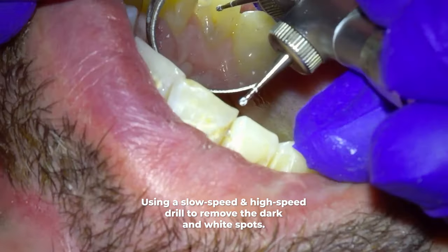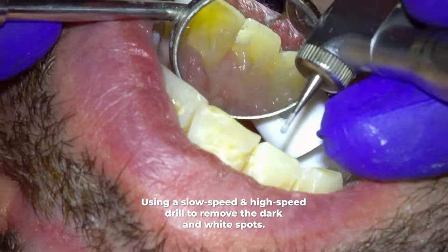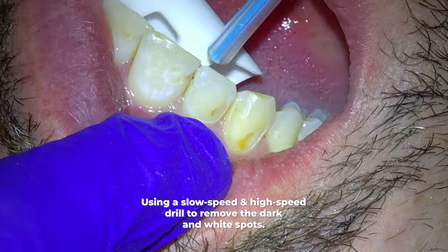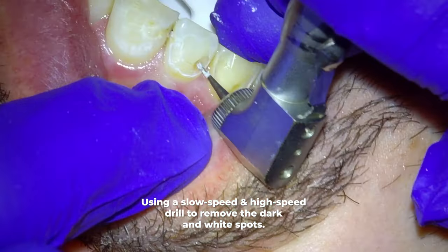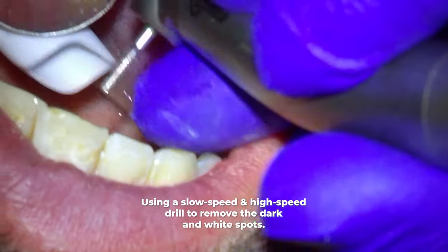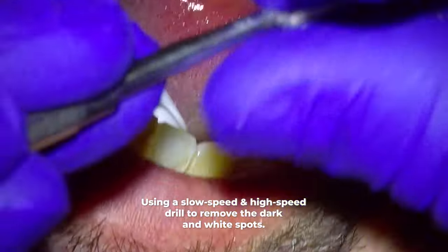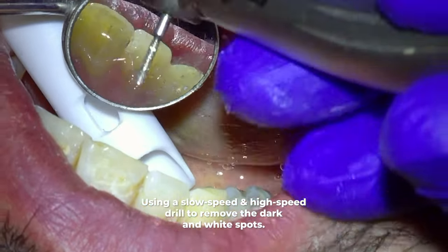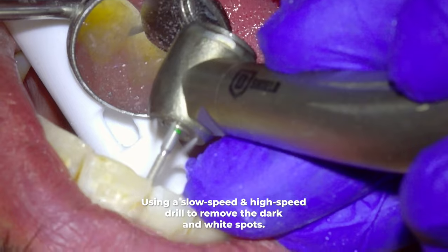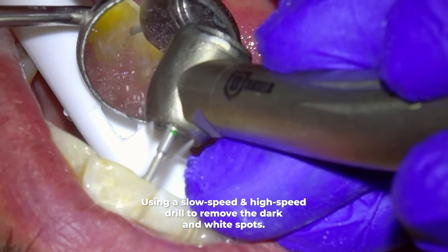Besides getting to the more dusty tooth debris, you can tell decay is gone by a more yellow appearance of the dentin, instead of the orangey or brown appearance as we saw before. Going back to the between-the-teeth area, I'm going to remove the remaining decay with the high speed drill until the dark is all gone, then get any remaining decay with the slow speed drill again. You don't have to remove all the decay with the slow speed drill — I just did that to show you what it looks like. But you do want to use the slow speed drill to confirm all the decay is gone.